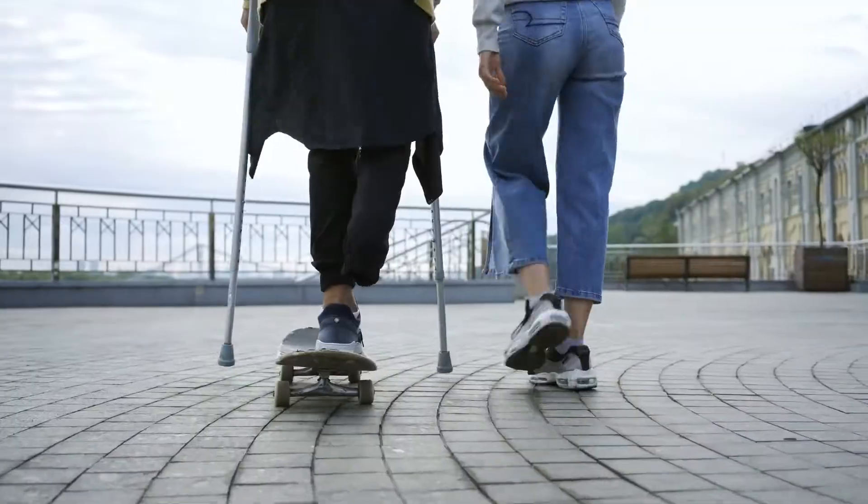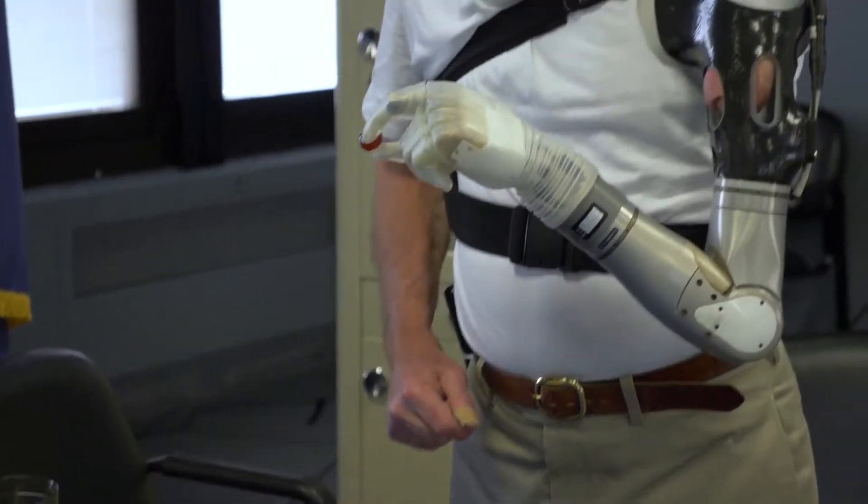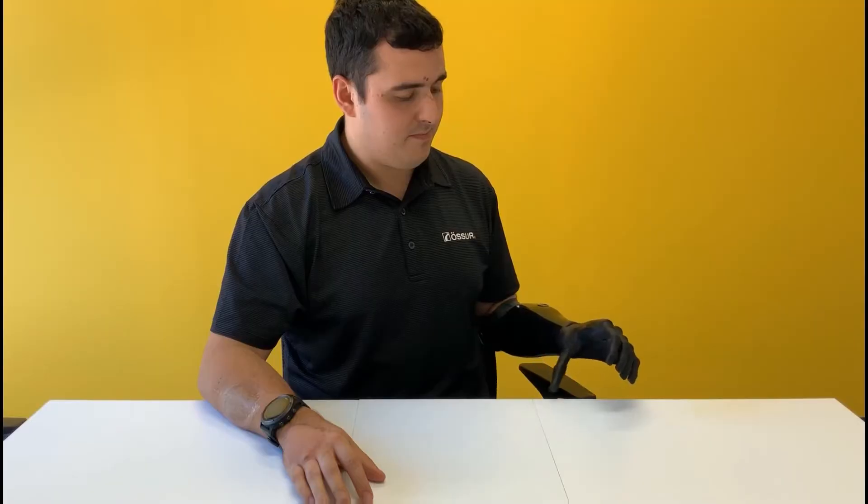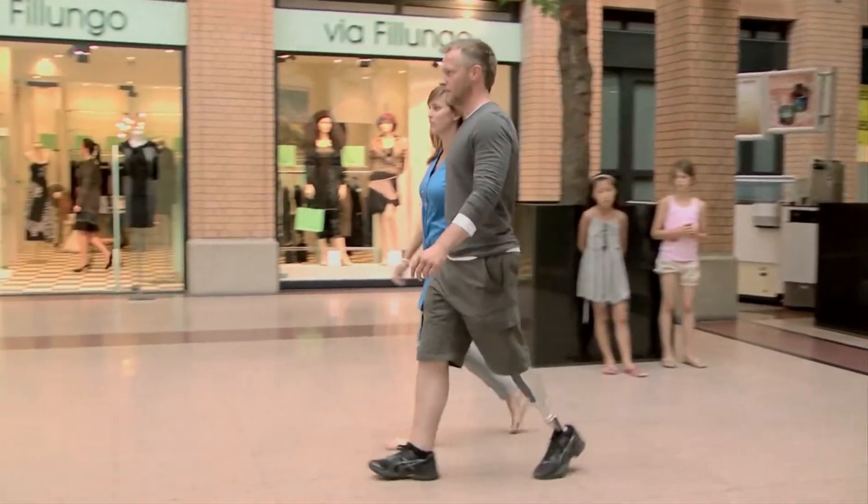Losing a limb is nothing short of devastating, but modern technology has made it possible to continue leading a normal life. The most common way to address the loss is a prosthetic arm or leg, which does a pretty good job of returning some flexibility and dexterity to the person wearing it.